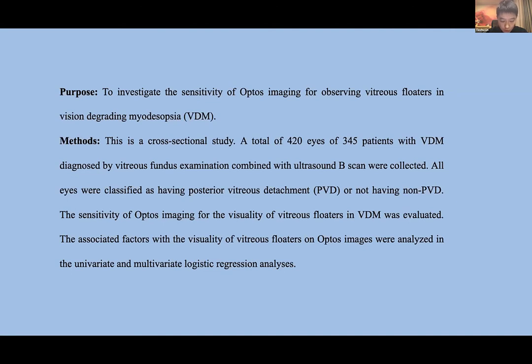The sensitivity of Optos imaging for visibility of floaters was evaluated. We used the full pixels, 3900 by 3072, of Optos images to find floaters.